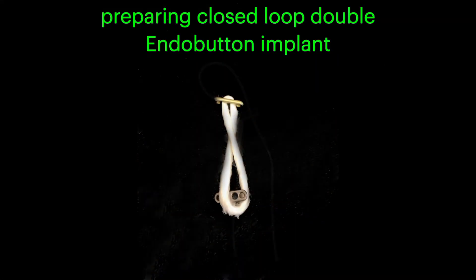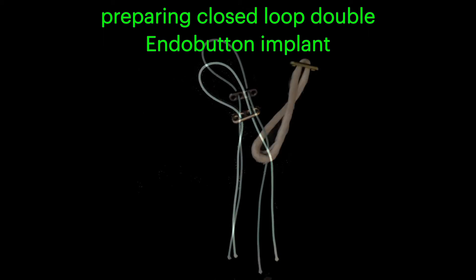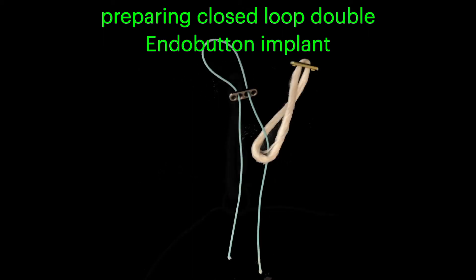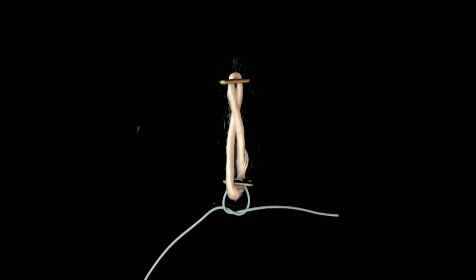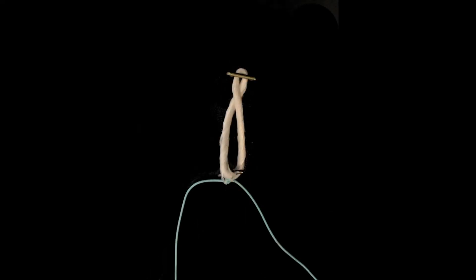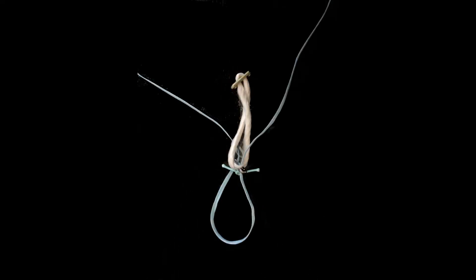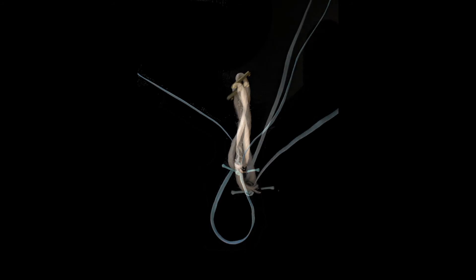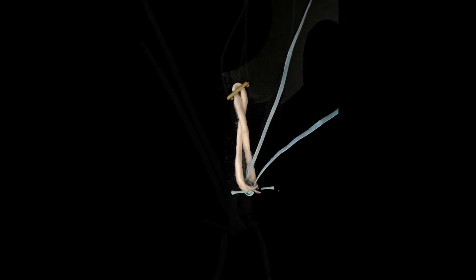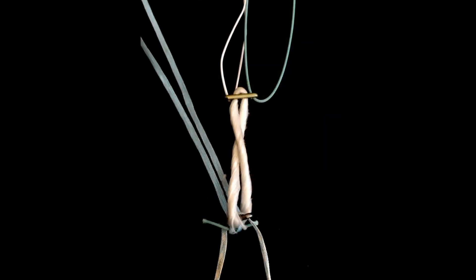The implant is now prepared at the back table. A suture is passed through the near holes of a free endobutton and then tied around the loop so that the loop goes around the button. An ultra tape is then passed through the near holes of the endobutton. A rescue stitch is then passed in the opposite direction of the far holes so that the button position can be controlled during passage.